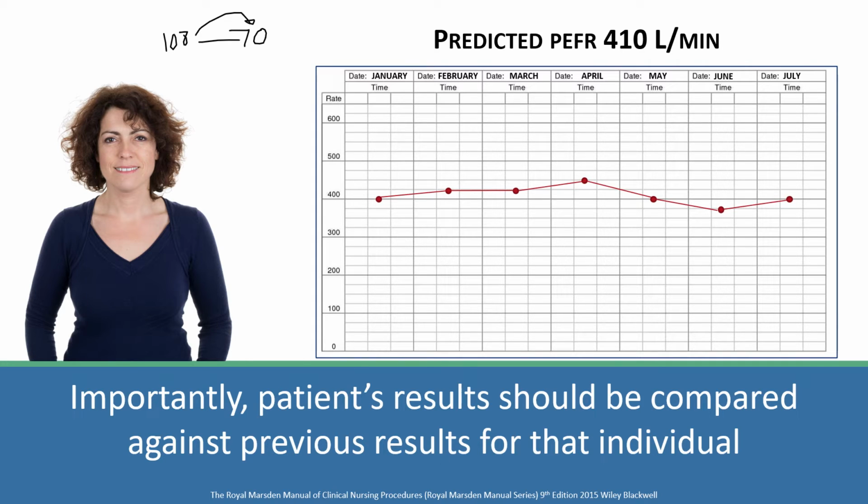If last year it was 54, we're not chuffed with that. It's the same result, but when we compare it to how it's been previously, it affects the way that we interpret it. And that's how it should always be with asthma as well. So never interpret it as a one-off.